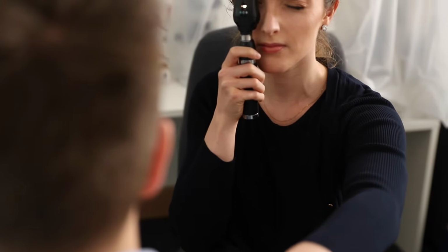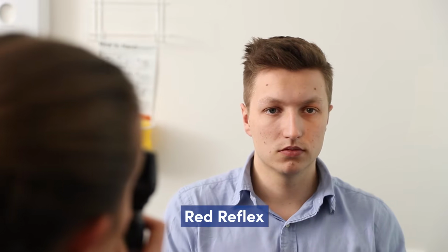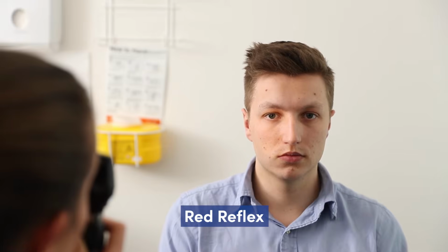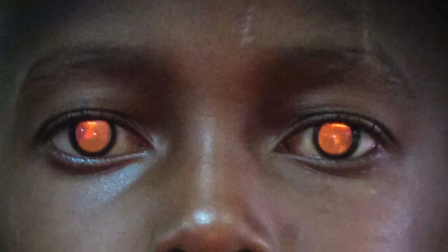Stand or sit at arm's length with the ophthalmoscope at the patient's eye level, turned on with the appropriate aperture and filter setting. Prior to fundoscopy, assess the red reflex and examine the anterior segment, or front part of the eye. The red reflex is assessed at arm's length by aiming the light beam into each pupil and observing the reflected glow, which should be a fairly symmetric orange-red color.